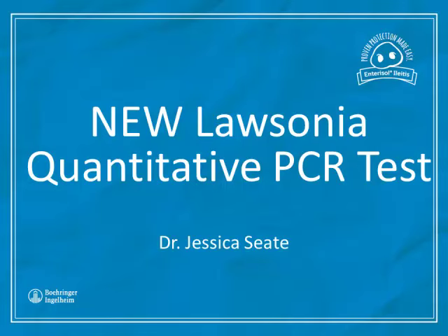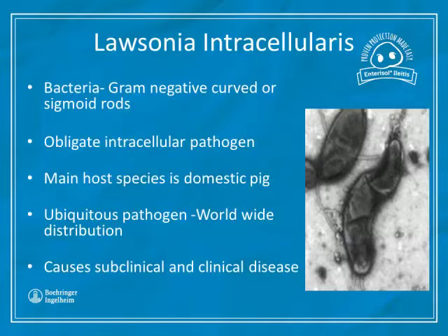So I'm here today to present our new Lawsonia Quantitative PCR test. Just wanted to give a bit of a review of Lawsonia. Again, it's a bacteria, gram-negative, curved or sigmoid rod, which you can see here. It's an obligate intracellular pathogen. So like Mike mentioned, it will be in the epithelial cell.